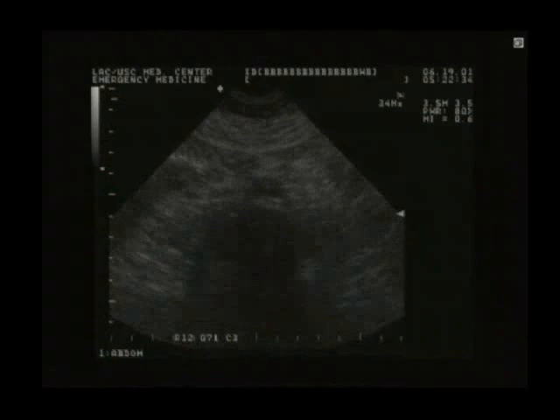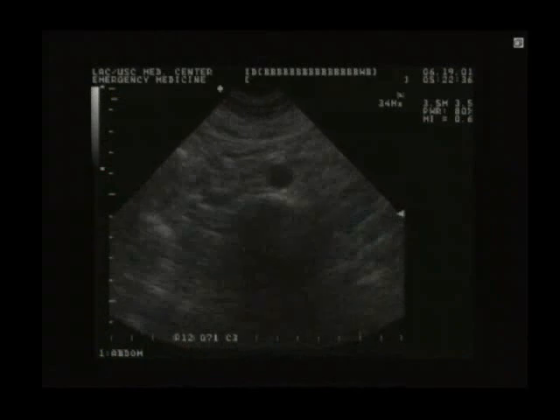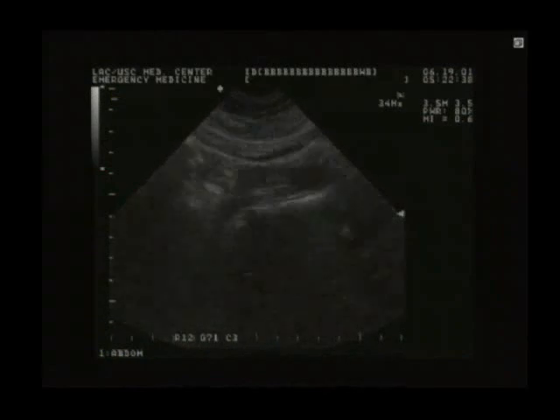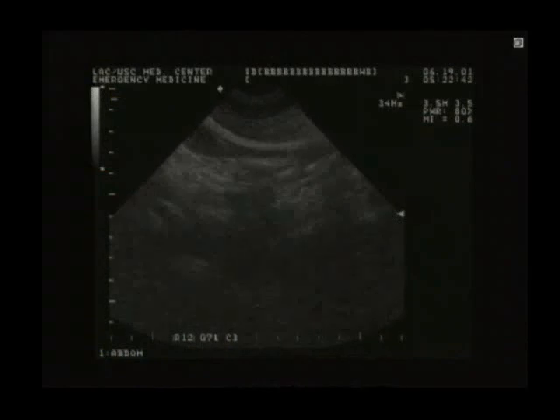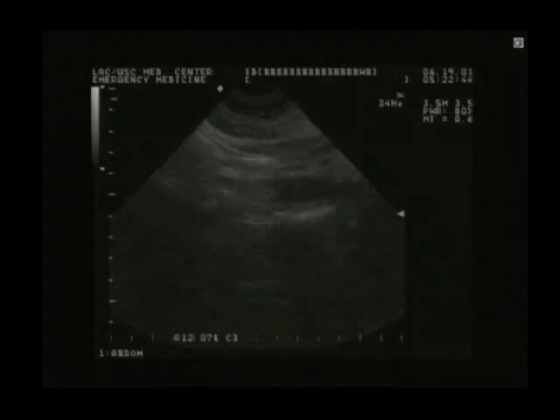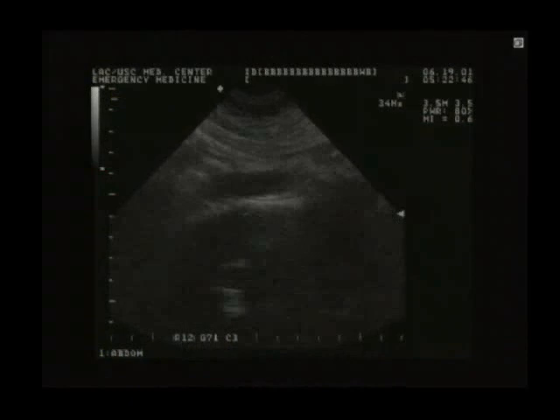So you document these for your QA. You take a picture at the beginning. You take a picture at the bifurcation. Those are your documentation. Well, multiple views all the way along. Yeah, the 3 or 4 views, and a longitudinal. That would be ideal.